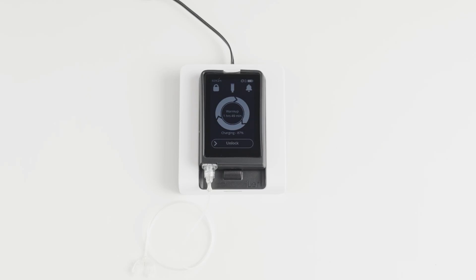A fully charged eyelet will last several days without charging. Your eyelet's battery life will depend on how much it is used, including how often the backlight is turned on and how much insulin is delivered.